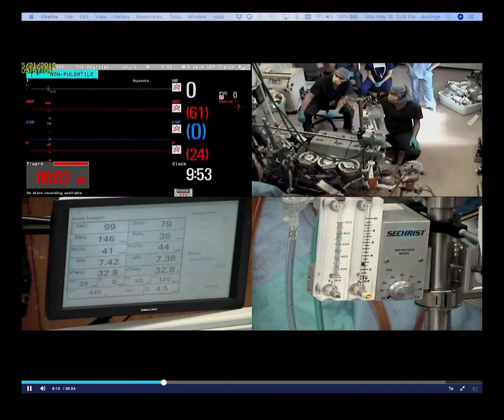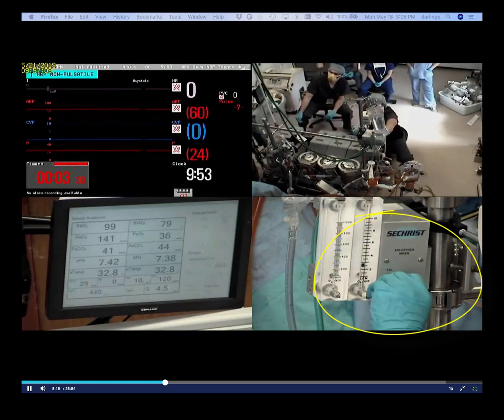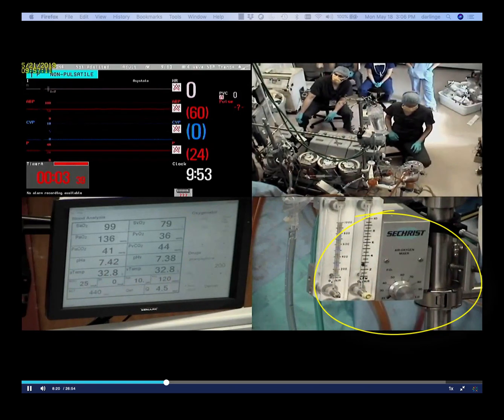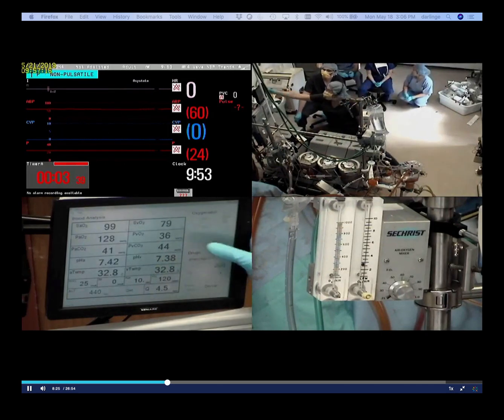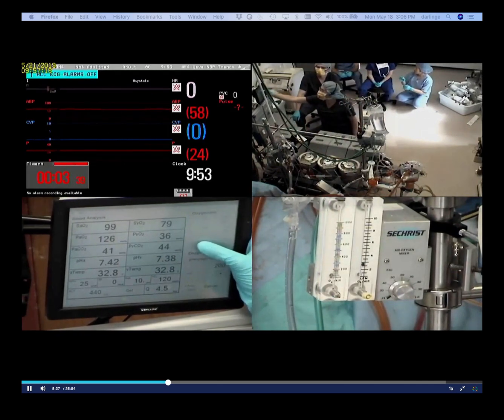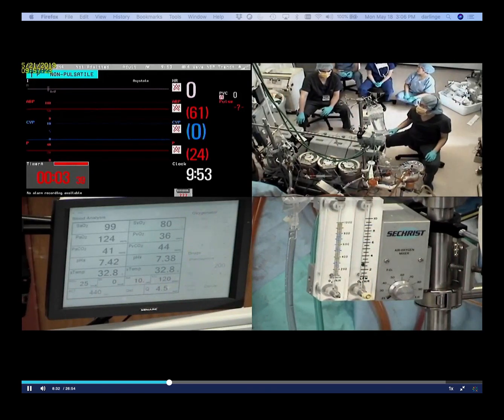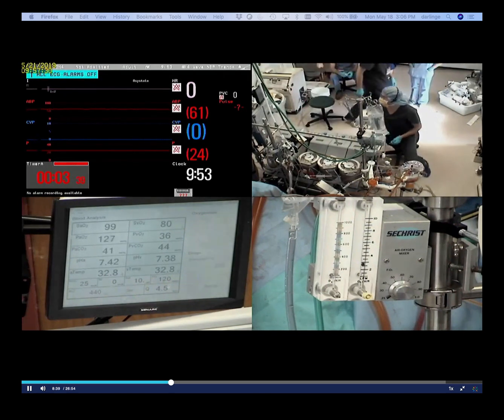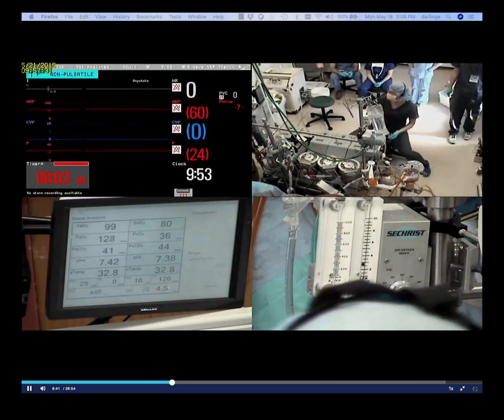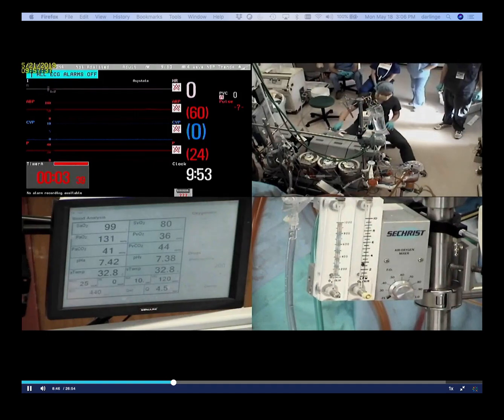It's rising right now, so I'm okay for now, but I'm going to turn it up even higher to see if I can get that PaO2 up a little more. I'm going all the way up to 100 on my FiO2. I think I'm having an oxygenator failure — my PaO2 is dropping fast and I'm at FiO2 of 100 percent.